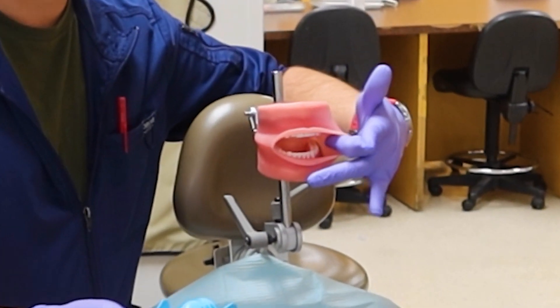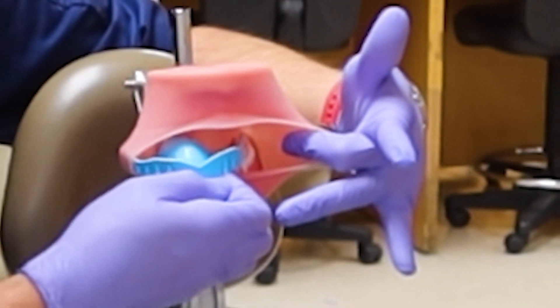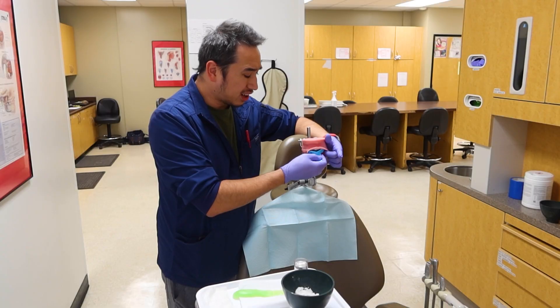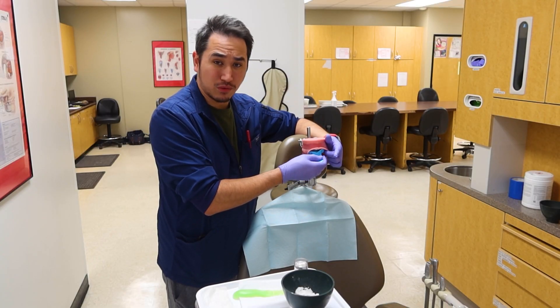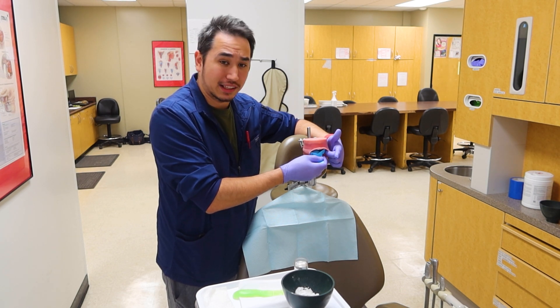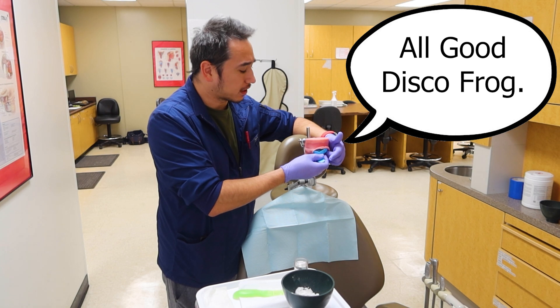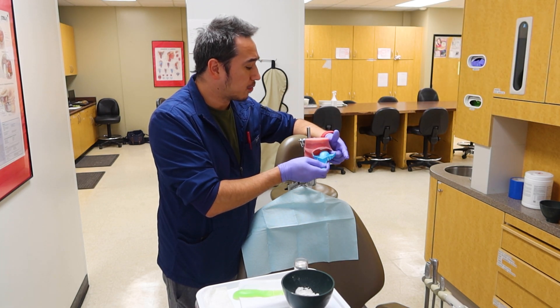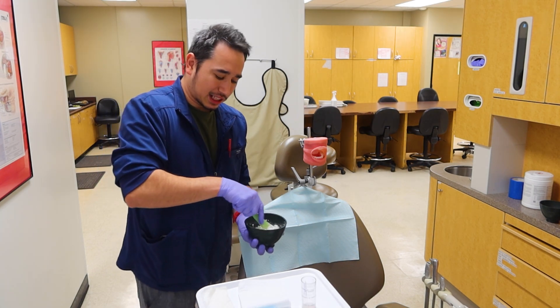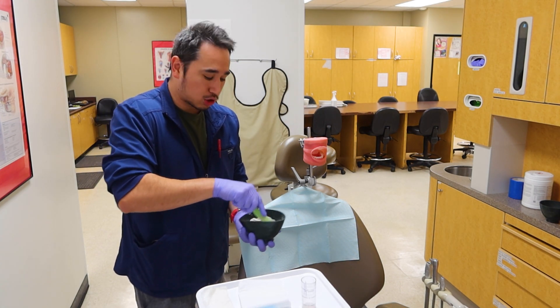As you try the tray in, pull over to the side as we mentioned, sweep it in from the other side, and feel and check. Also check with your patient — apart from what you can feel, sometimes they might feel some sore spots or high places where the tray might be acting up. Ask: 'Do you feel anything that hurts right there?' It's also nice to have a little extra water on the side just in case you measured a little bit too dry.